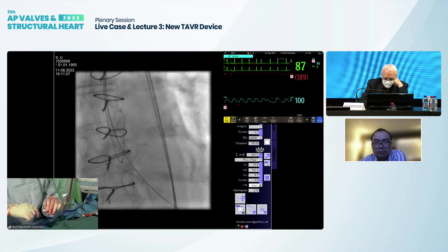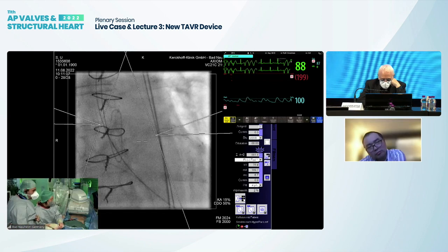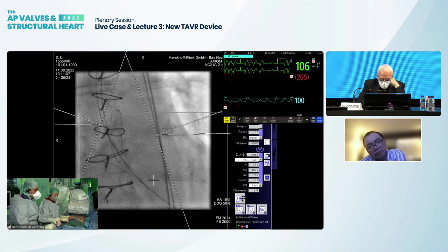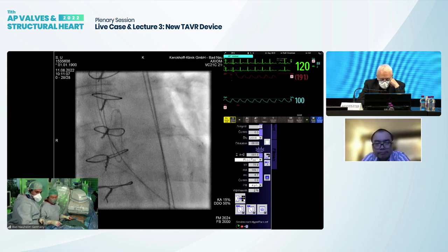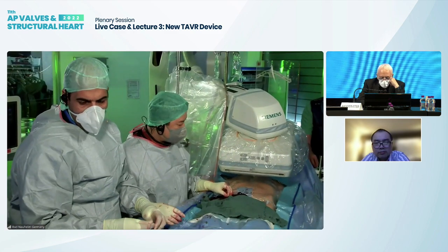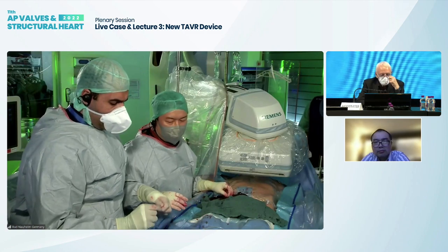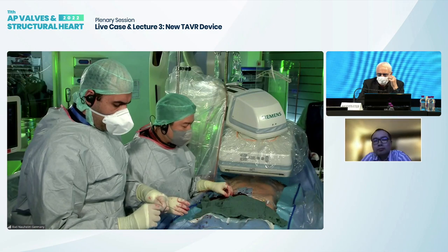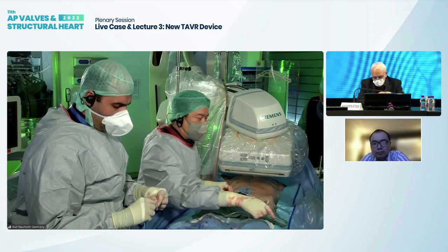Yeah. And now we have passed the aortic valve. We will later on verify this with an aortic root shot just for you to demonstrate. Usually we do not do aortic root shots to verify the cusp view because we think that even though you have maybe 5 degree deviation, I don't think it majorly affects the implantation plane.